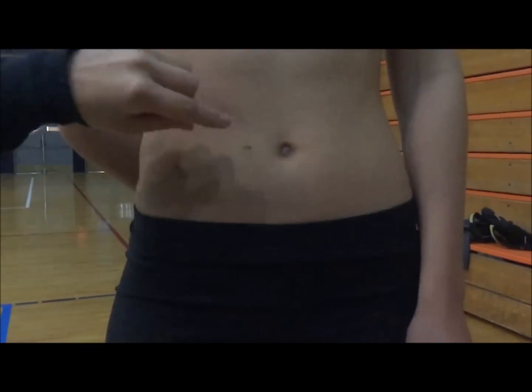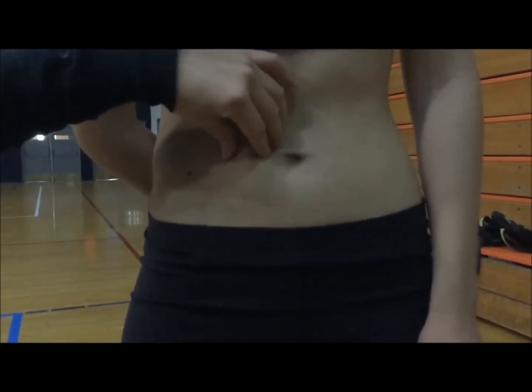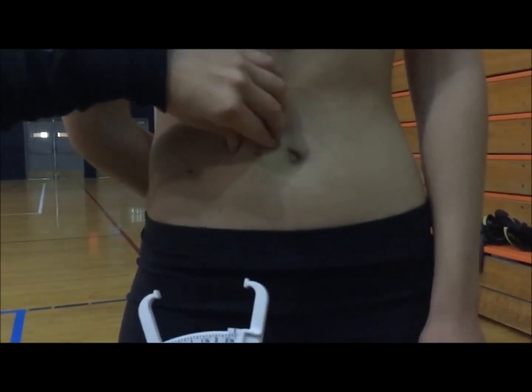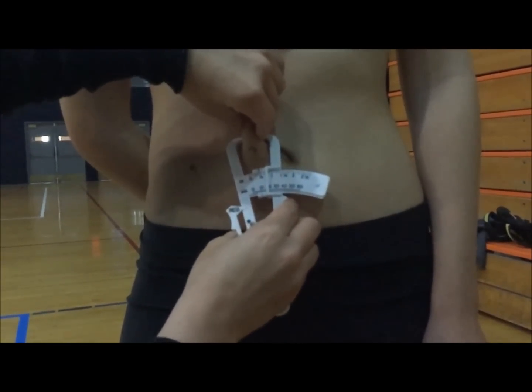The same with the vertical fold in the abdominal area, maintaining the pinch as you take the measurement.